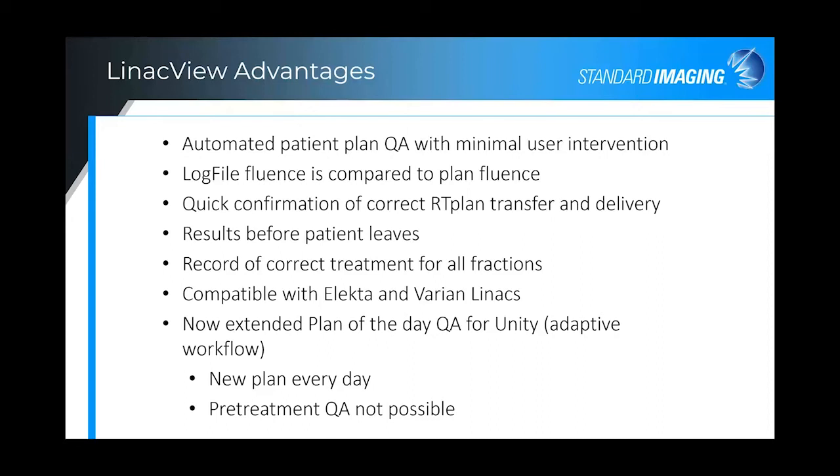There are many advantages to offset the limitations, such as the automated patient plan QA with minimal user intervention. As already mentioned, the log file fluence is compared to plan fluence. You get quick confirmation that the correct RT plan has been transferred and delivered.